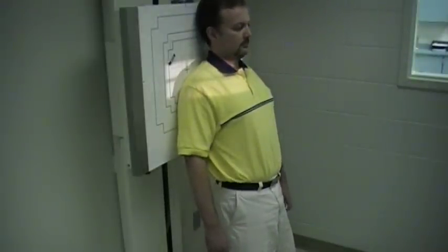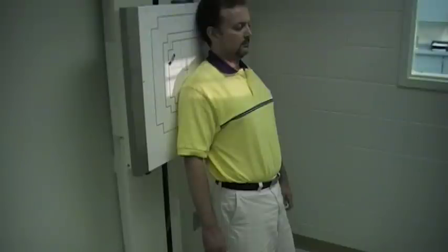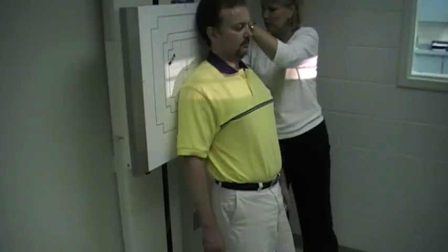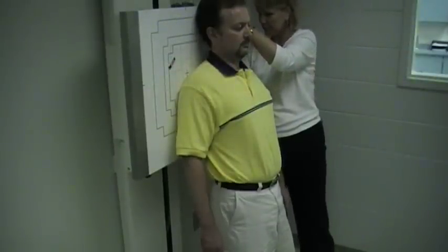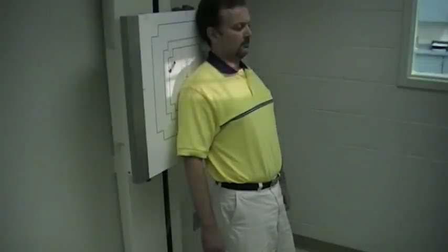And I'm also going to add a 15-degree cephalic angle to this. And this will help ensure having the clavicle projected up above the apices of the chest. Because when you do the lordotic, the AP axial clavicle, you want the clavicle on the resultant image to project higher than the ribs and the very top of the lungs. So that is our AP axial clavicle with the patient in the lordotic position.